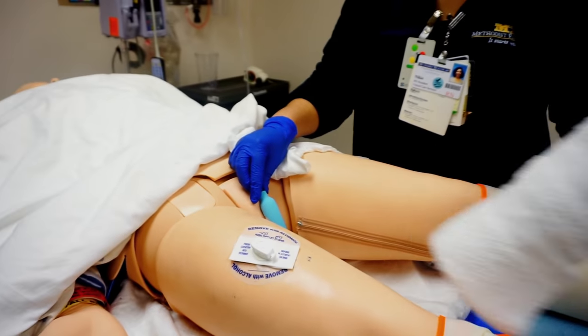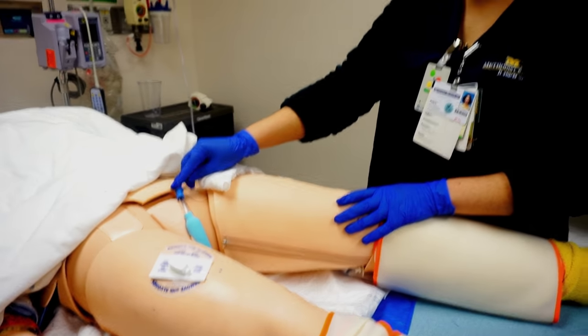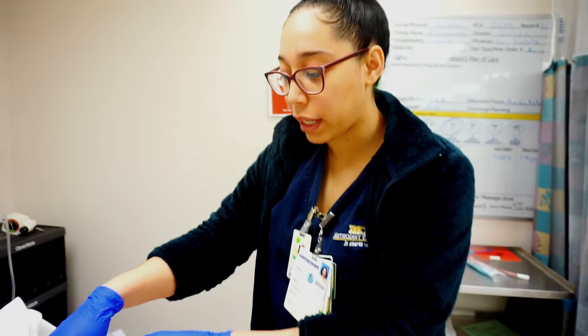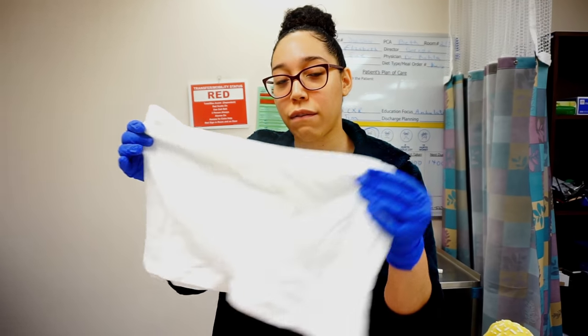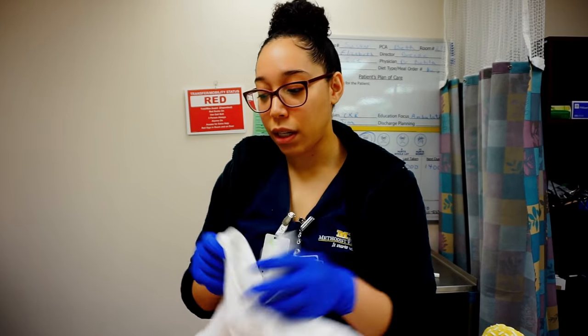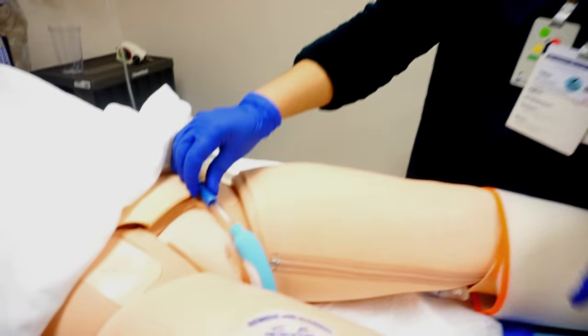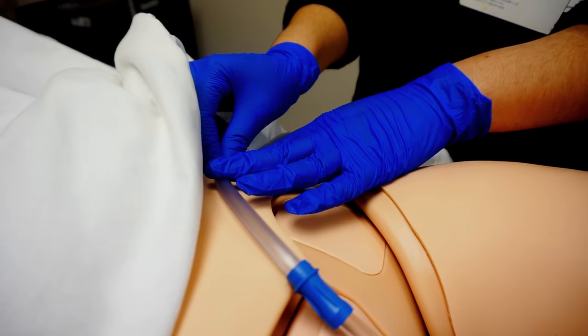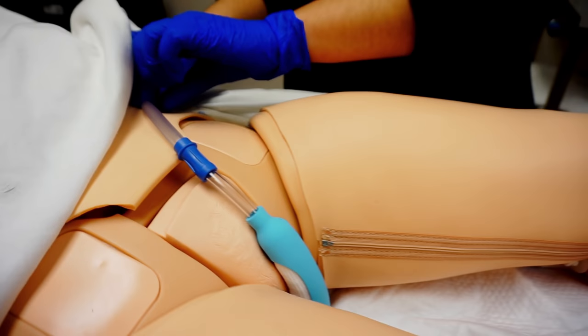Another modification: if you have a patient who is extremely underweight and when you close their legs the Purewick is still moving out of place, you can place mesh underwear — available on the floor — on the patient to help stabilize it. You can also put a piece of tape right here to stabilize the tubing itself.